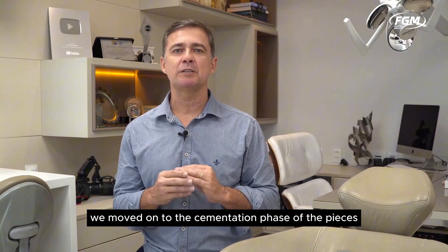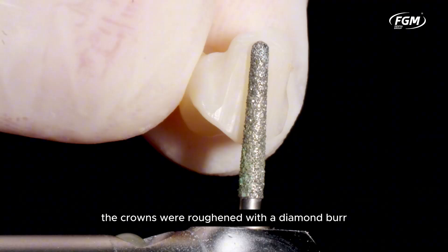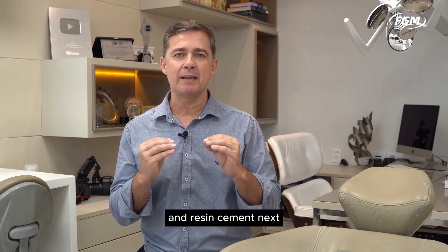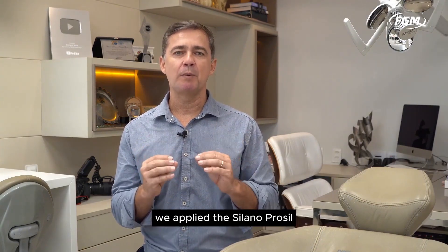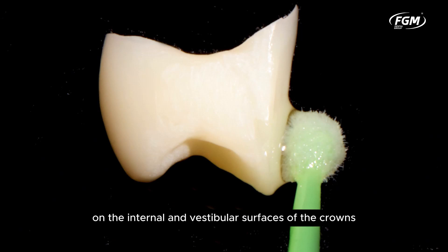We then moved on to the cementation phase. Initially, the crowns were roughened with a diamond burr in the regions that would receive the addition of composite resin and resin cement. Next, after disinfecting the pieces with 70% alcohol, we applied Silano Prosil FGM for two minutes on the internal and vestibular surfaces of the crowns.